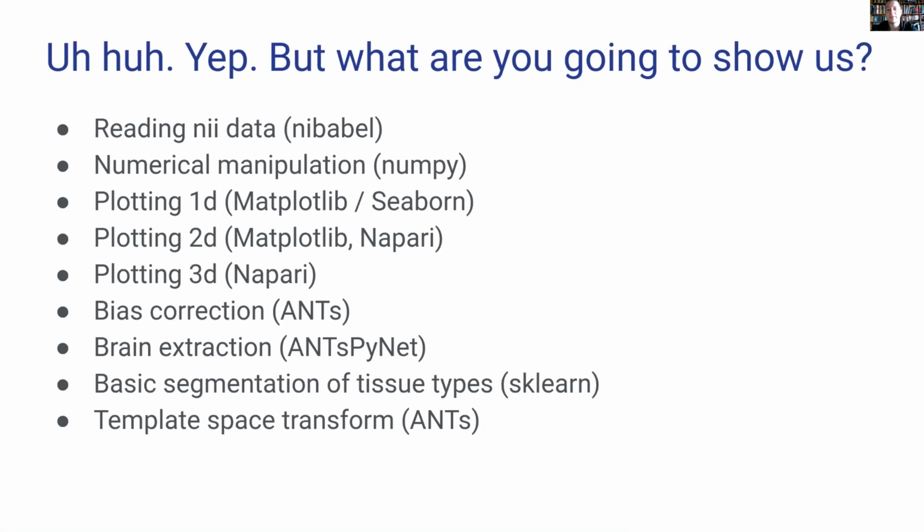So I'm going to be reading the data in with a package called nibabel. I'm going to be doing some numerical manipulation using everyone's favorite Python matrix manipulation software, NumPy. I'm also going to be doing some plotting in 1, 2, and 3 dimensions of the MRI using matplotlib, Seaborn, and Napari. And thank you very much to Dr. Freda Vertiger for putting me onto Napari. It is very, very wonderful, as hopefully I will sell you on it later.